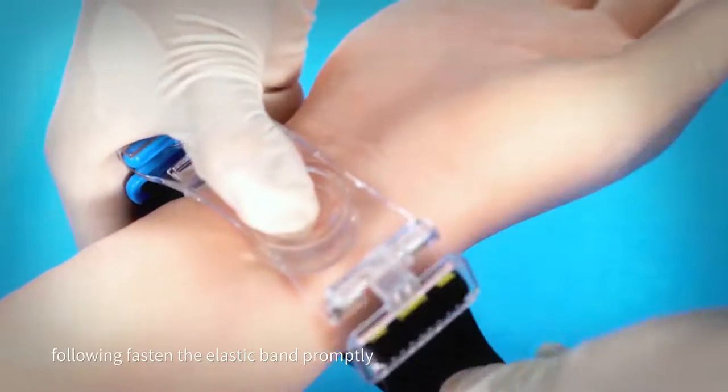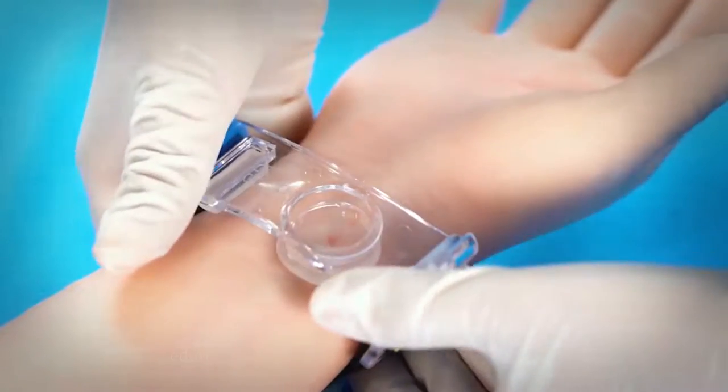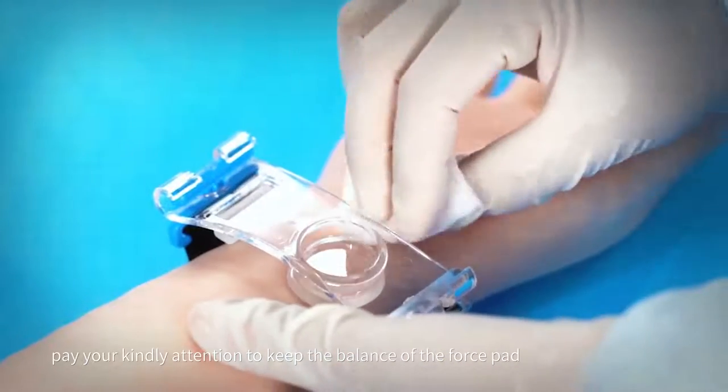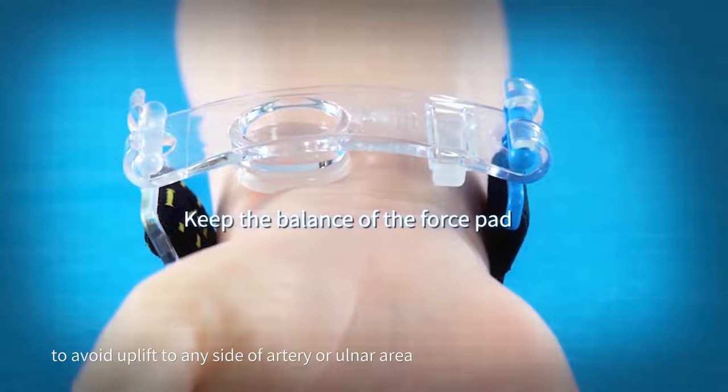Following, fasten the elastic band promptly. During the procedure, pay attention to keep the balance of the force pad to avoid uplift to any side of the artery or ulnar area.